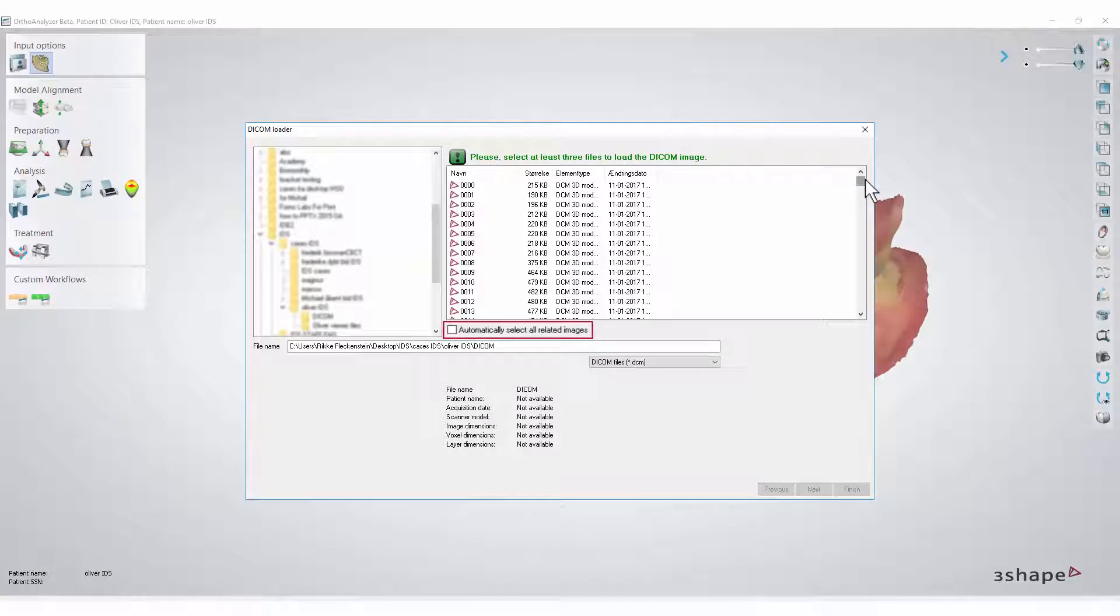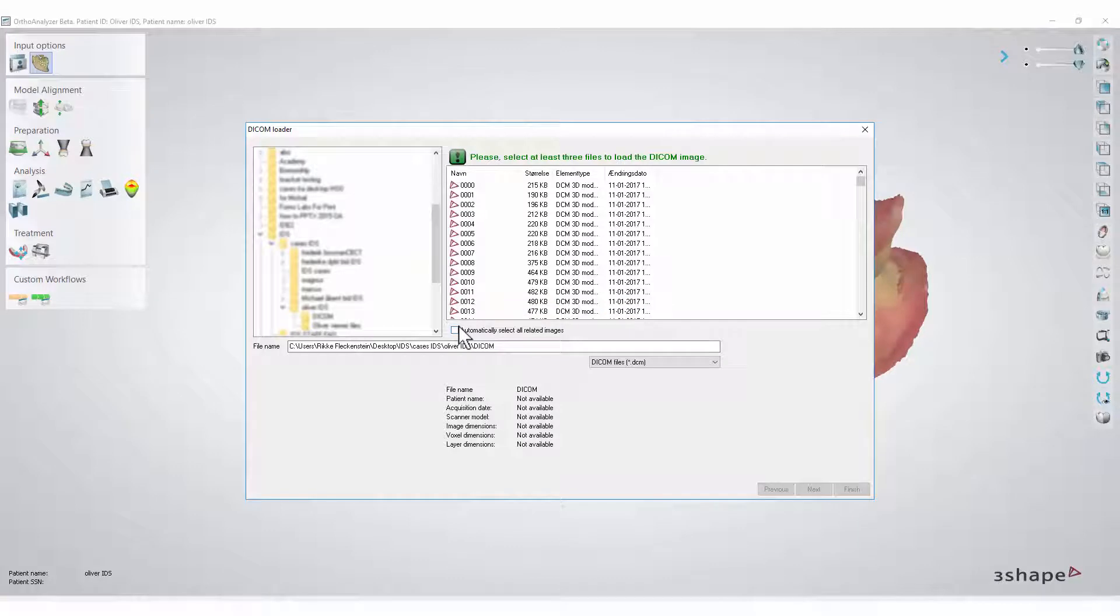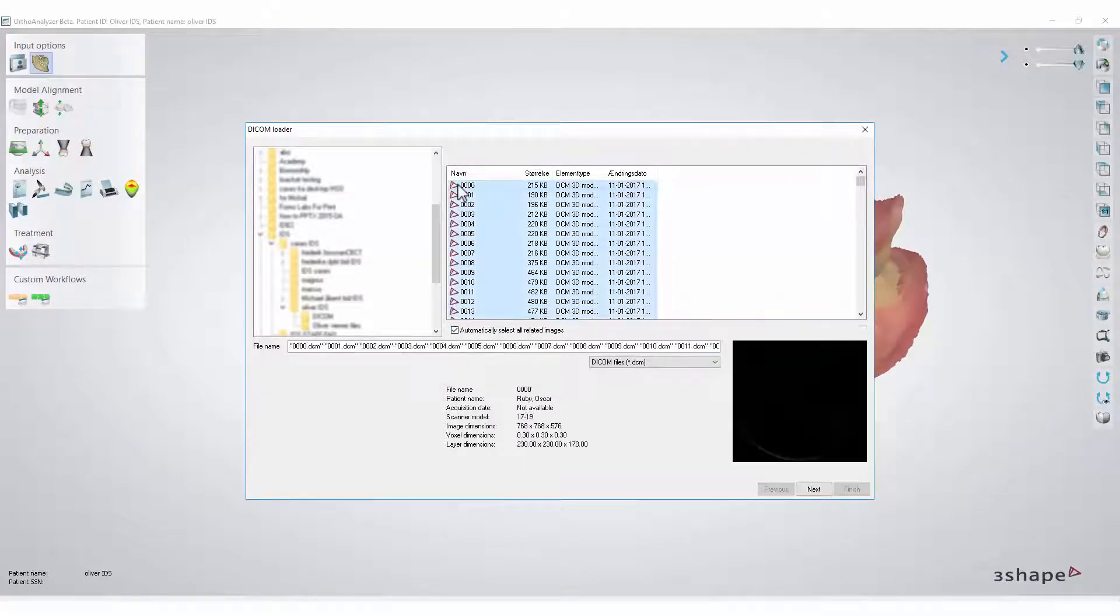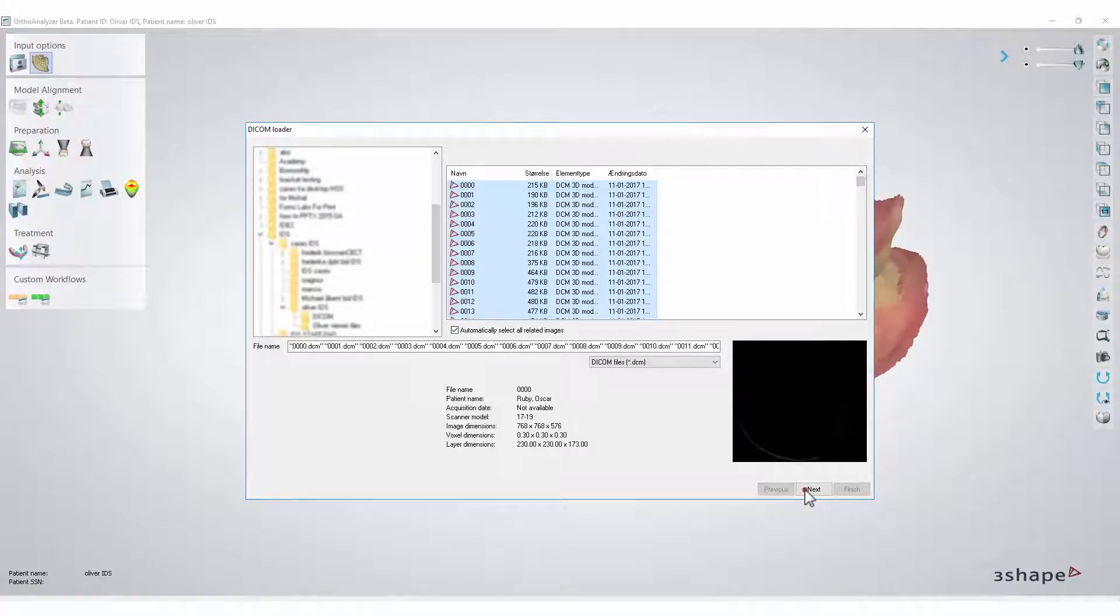Enable the Automatically select all related images tick box. Now, when you click one of the DICOM files, all of them will be automatically downloaded. Click Next.